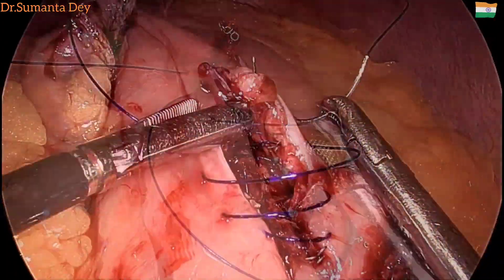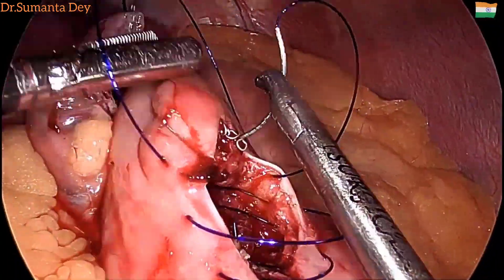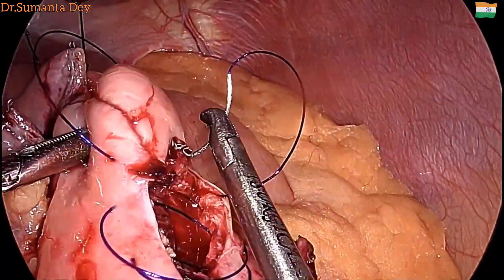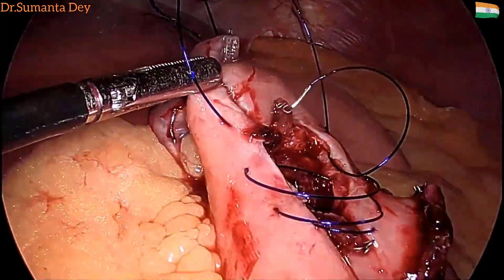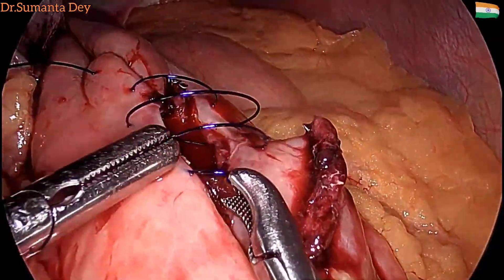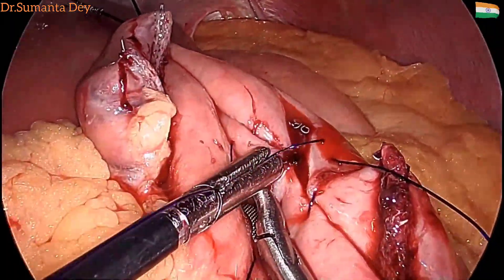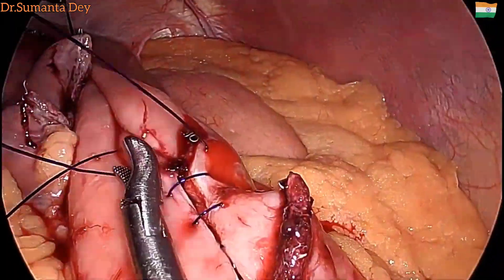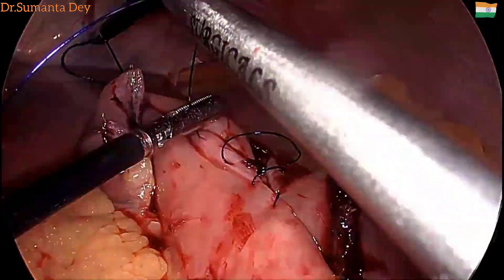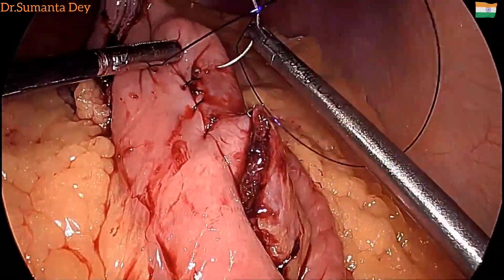In this way the anastomosis was completed. The whole operation took almost one and a half hours and the post-operative recovery was uneventful. The patient was mobilized on post-operative day zero, allowed liquid diet on day one, passed stool and started on soft diet on day three, and was discharged on post-operative day four. Biopsy report came out to be a benign low-grade GIST — all margins were free, immunohistochemistry marker was positive for GIST, and the patient is on regular follow-up and doing well.